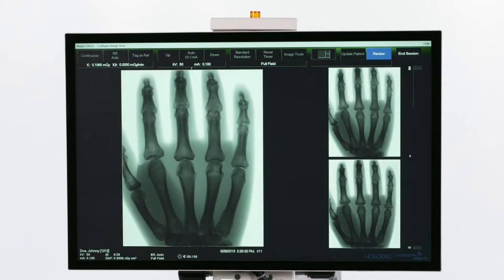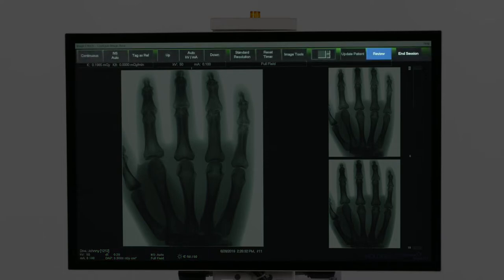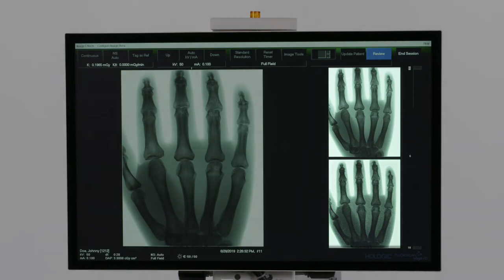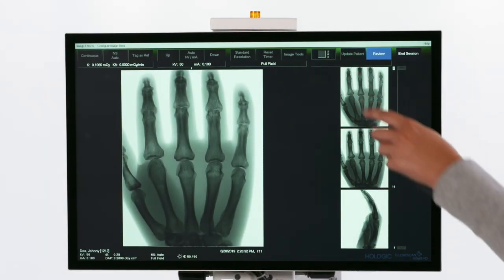The image acquisition screen has the cumulative DAP in the bottom left, the function buttons along the top, the image in the center, and the filmstrip of images on the right. The number of images in the filmstrip can be changed here.